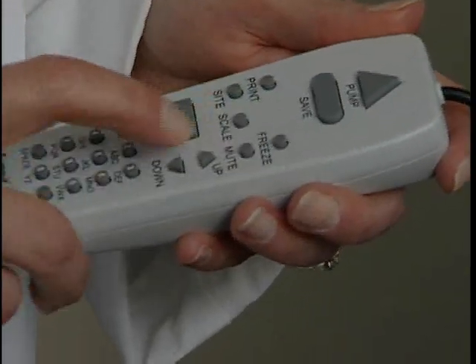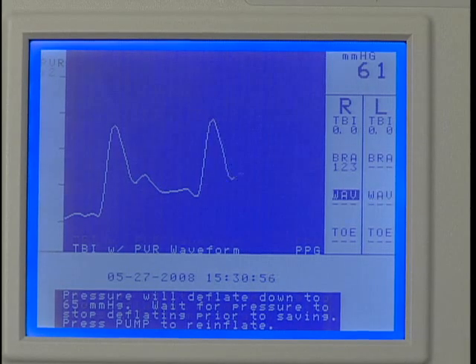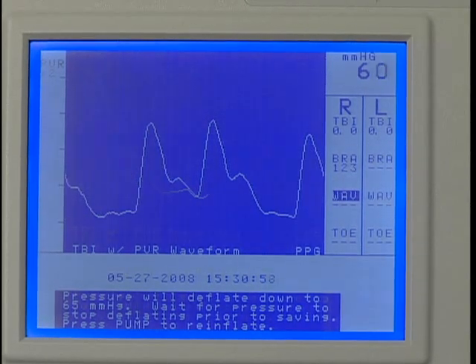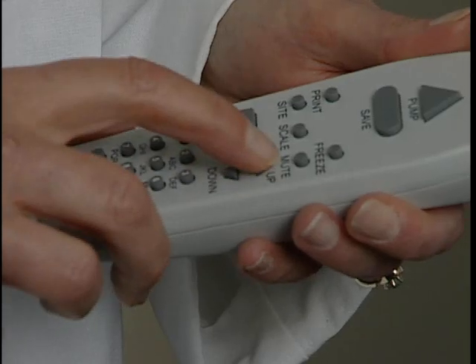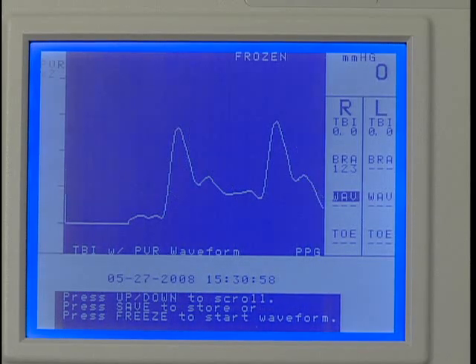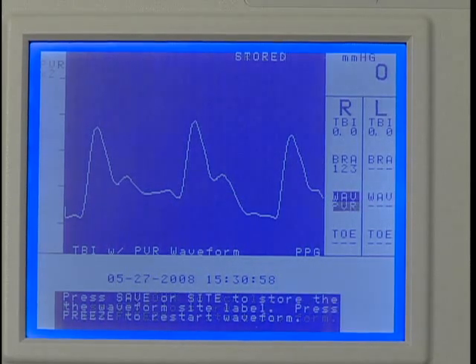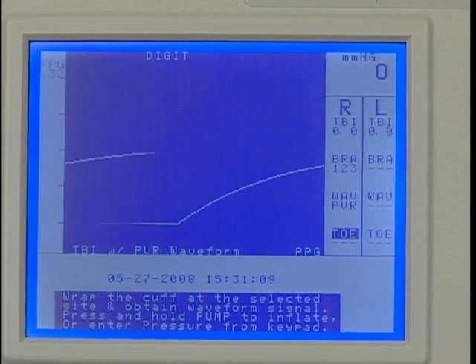If needed, use the scale key to optimize the waveform. After the waveform stabilizes, press Freeze. Here you have two options. If the waveform is acceptable, press Save to record it. Or use the up or down key to scroll to the optimum waveform, then press Save to record it. Press Save again to move to the next protocol location.